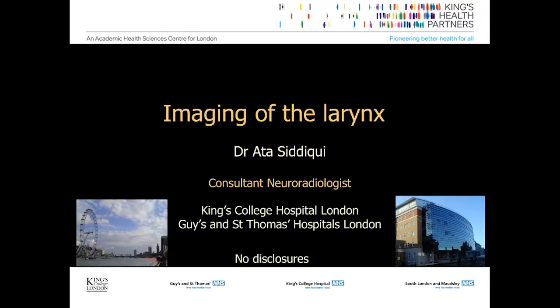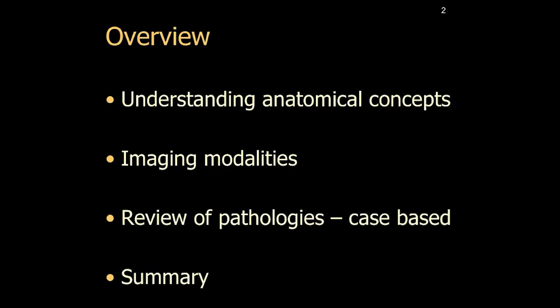Hello everyone. In this lecture, I will be talking about imaging of the larynx. This is what we intend to cover. We will start with some anatomical concepts, discuss various imaging modalities, and then look at some pathologies using a case-based approach before we finally summarize.